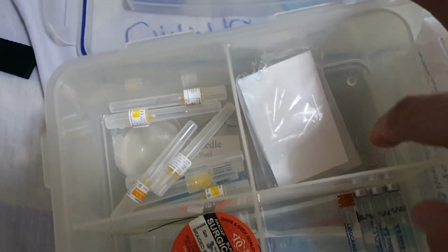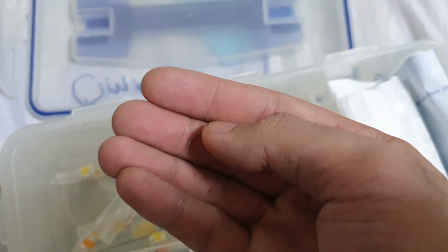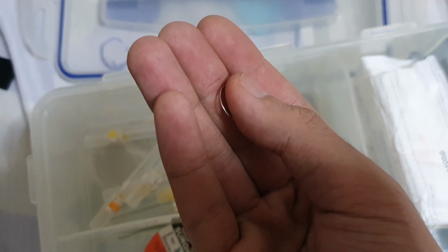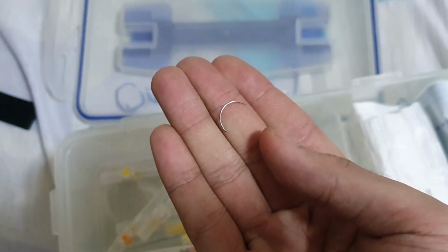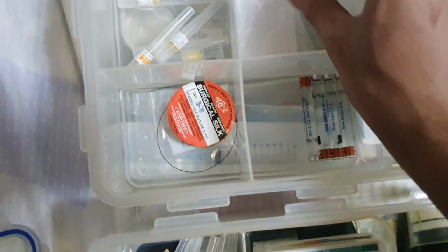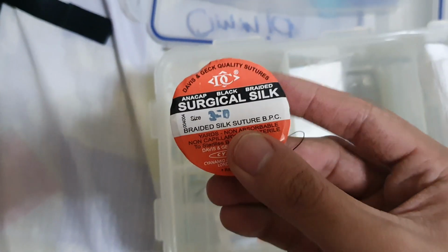And this, of course, you cannot see it. Oh, here, the suturing needle. This is used for suturing the wound after we do our extraction using the forceps. This suture needle goes with this one also, the suturing thread. This is the suturing thread that we're going to use for the suture.